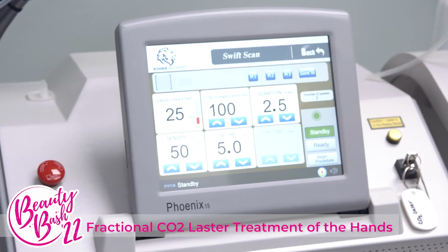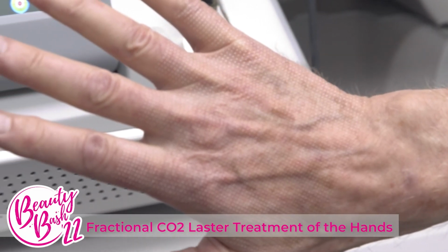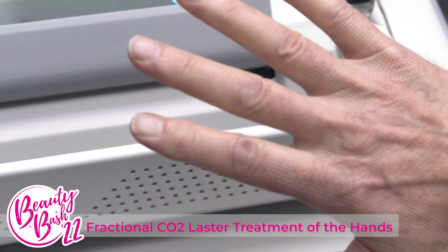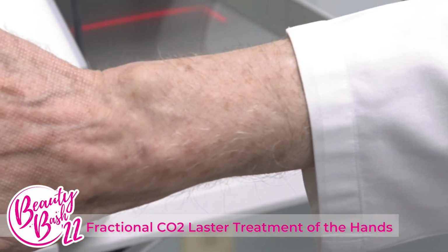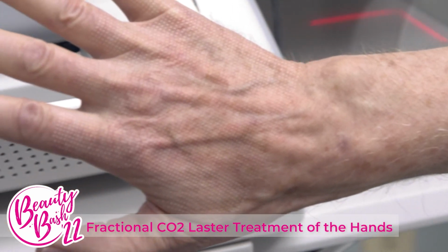After treatment, the skin will have many tiny, superficial holes visible that gradually close over a 2 to 3 week period with minimal care. Redness will be present for 3 to 4 weeks. Final results will be visible about 1 month after the laser treatment. If the hands are protected from further sunlight, repeat treatment may not be necessary for 1 to 2 years.